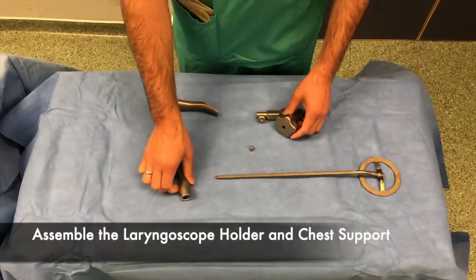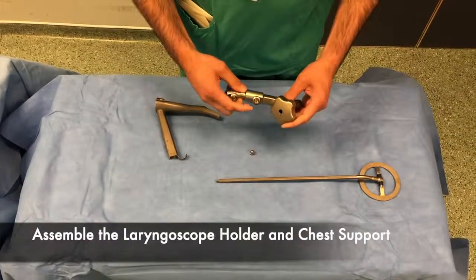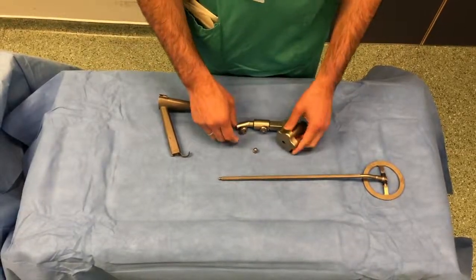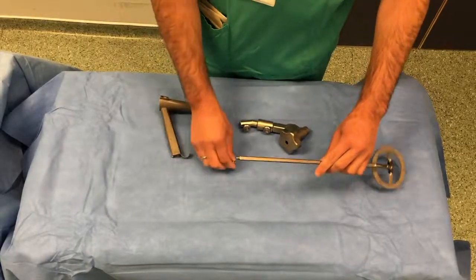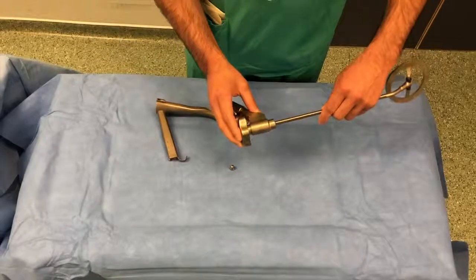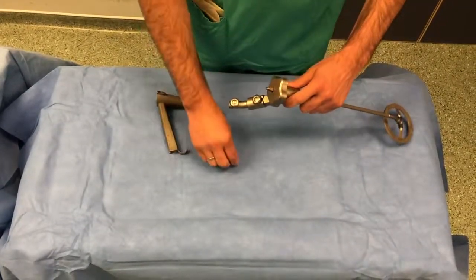The laryngoscope holder and chest support must be assembled as shown here. The laryngoscope holder is attached to the chest support. There is a small bolt that needs to be removed before threading the chest support through, which is then screwed in place.